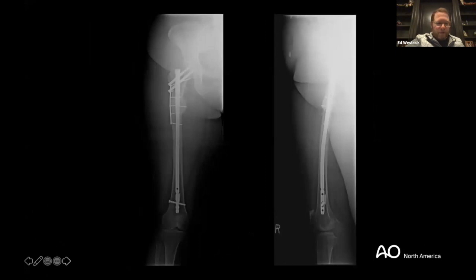Somebody had mentioned in the questions, I saw, their hospital only has hip nails. And so I think if that's all you have, certainly, then that's what you should use. And I think that's acceptable as well. But like Jeff has highlighted with these cases, maybe that means that's even more reason for you to be absolutely meticulous with your start point and your reduction and all those factors, everything Mitch and Jeff have talked about throughout this webinar.